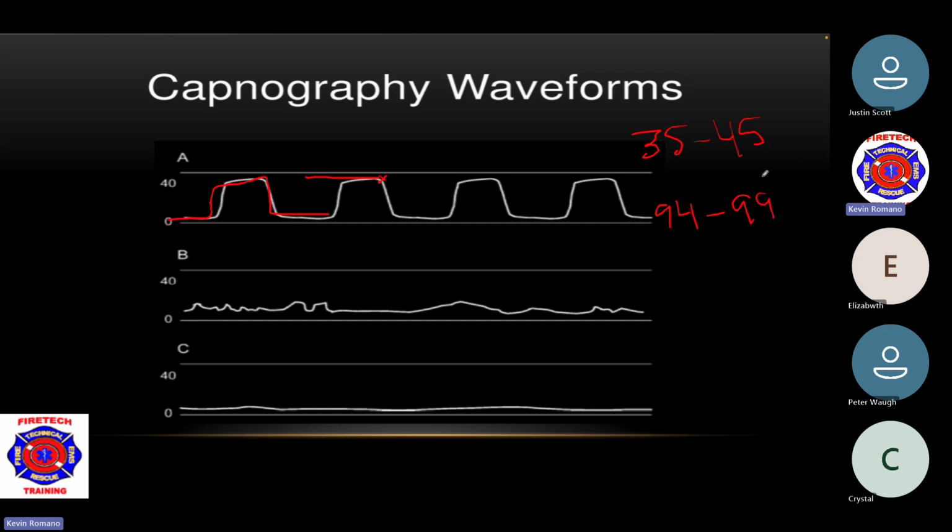What we're really focused on, though, is this. If we can't perfuse appropriately, then we're not going to be able to fix this. Okay, so we got to make sure we're perfusing appropriately. B and C, right, could be inaccurate readings, or the patient is no longer breathing, now they're apneic. Right, so let's kind of go into the difference.